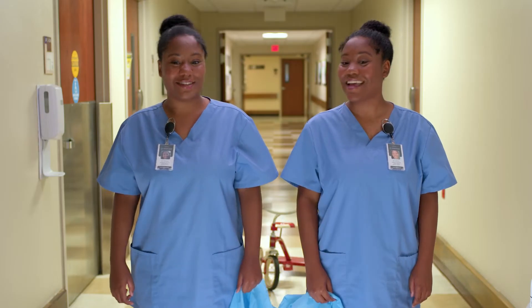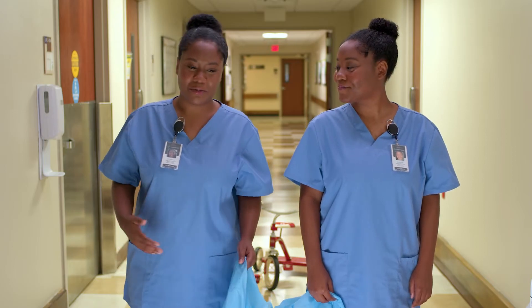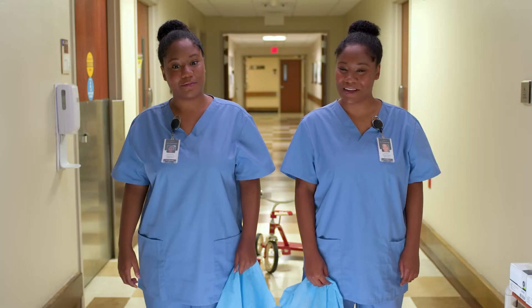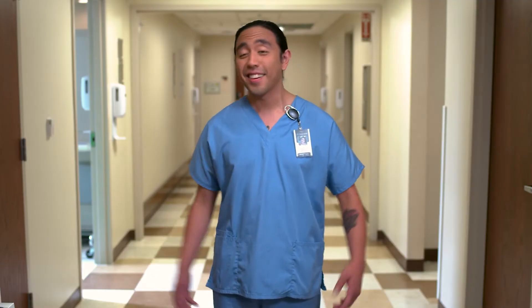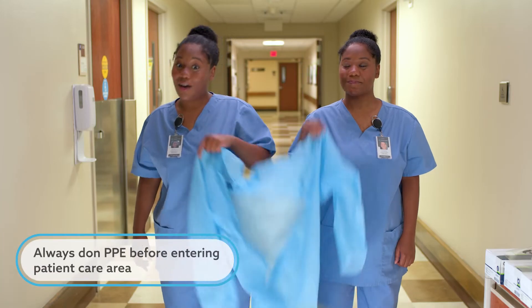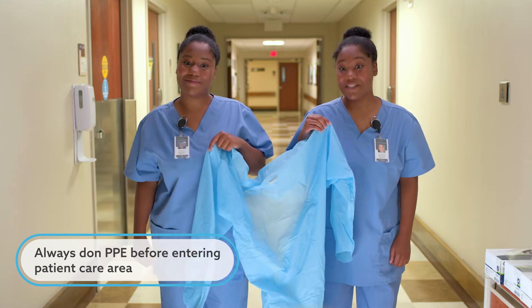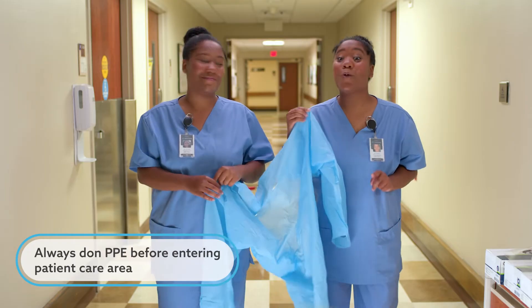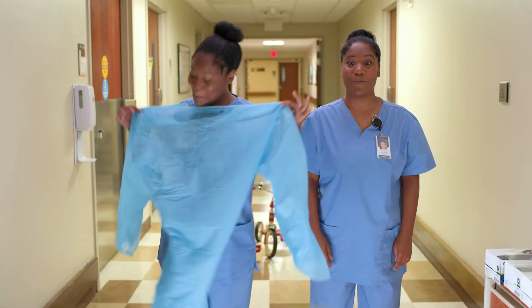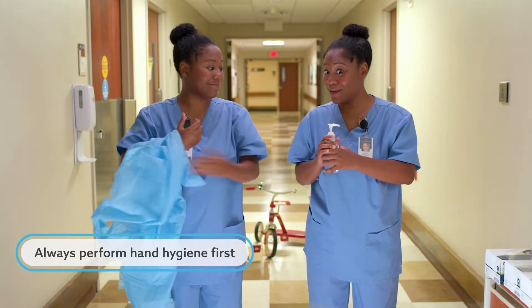Hello, I'm Miss Dawning. And I'm Miss Stoffing. Has the whole PPE thing got you confused? Anxious? Panicky? Not sure if you're doing it right? Well, don't worry, we've got you covered. Ready to start? Number one, always put on PPE before you enter the patient care area. Make sure to select the right PPE based on the infectious agent or situation, and the right size for you. But first, perform hand hygiene before donning any PPE.